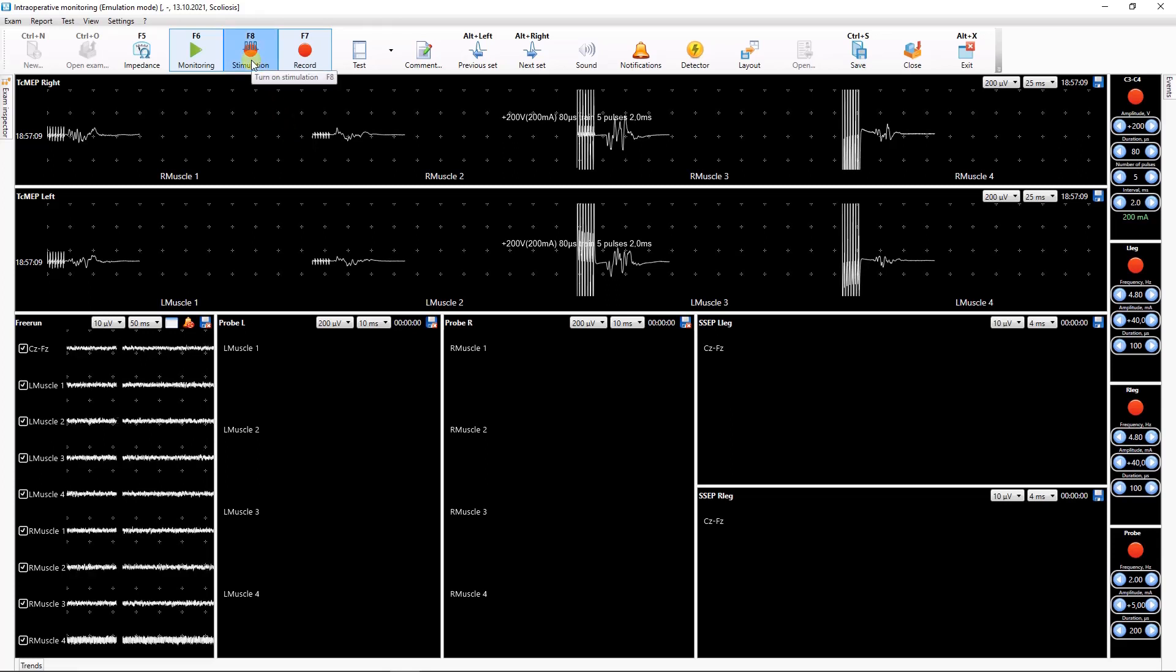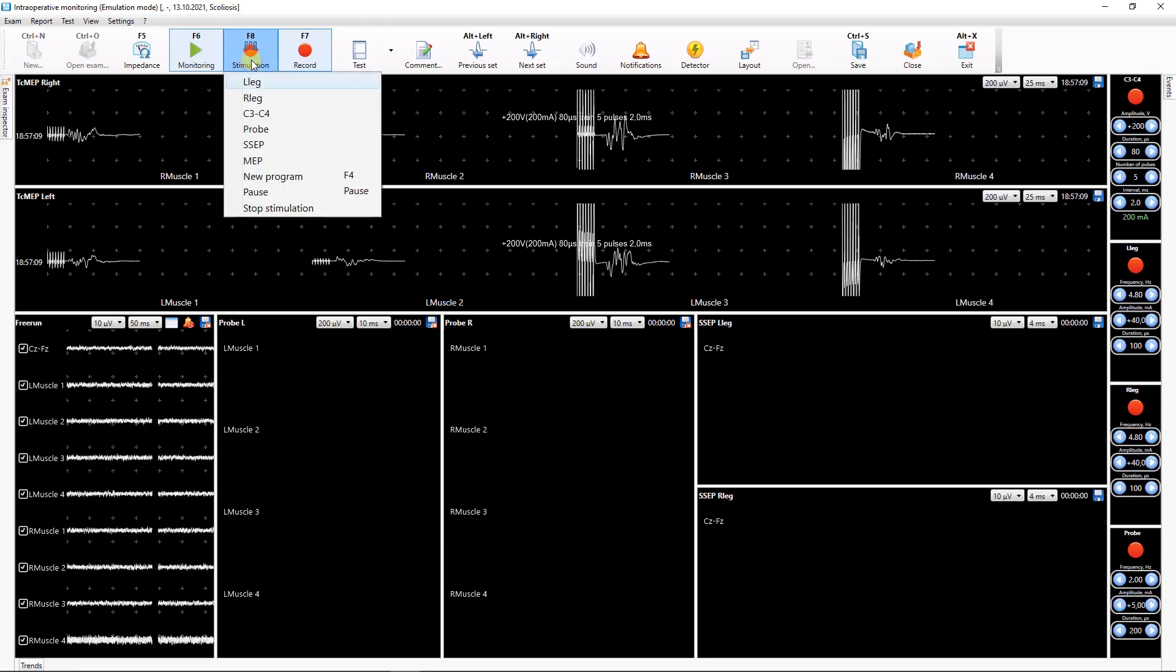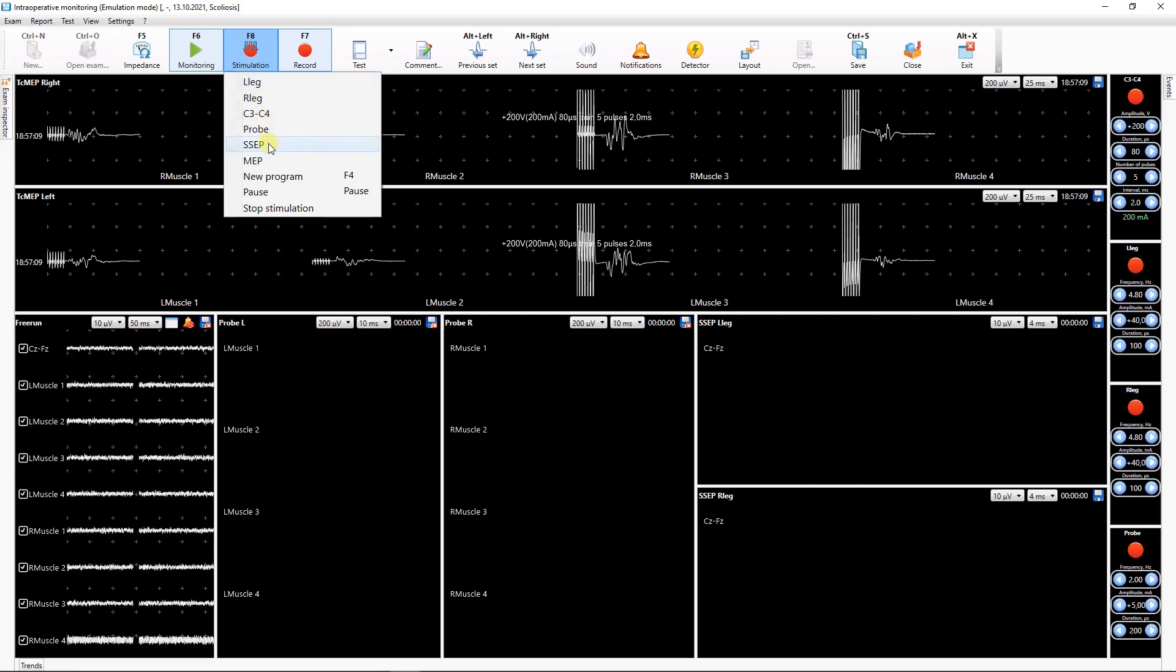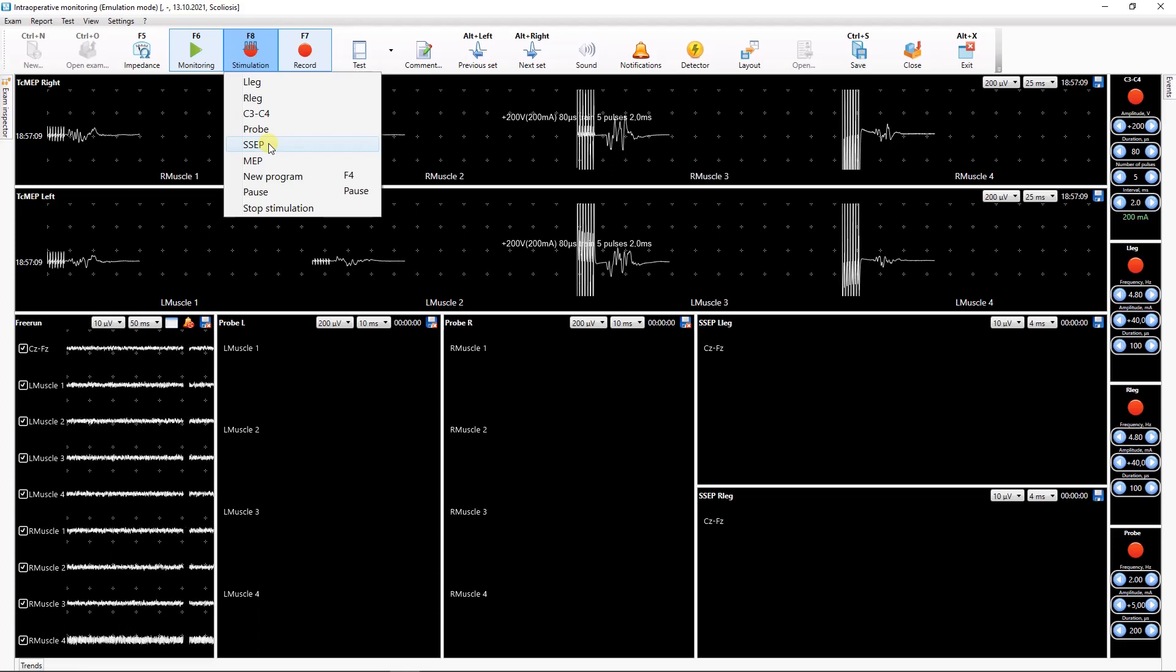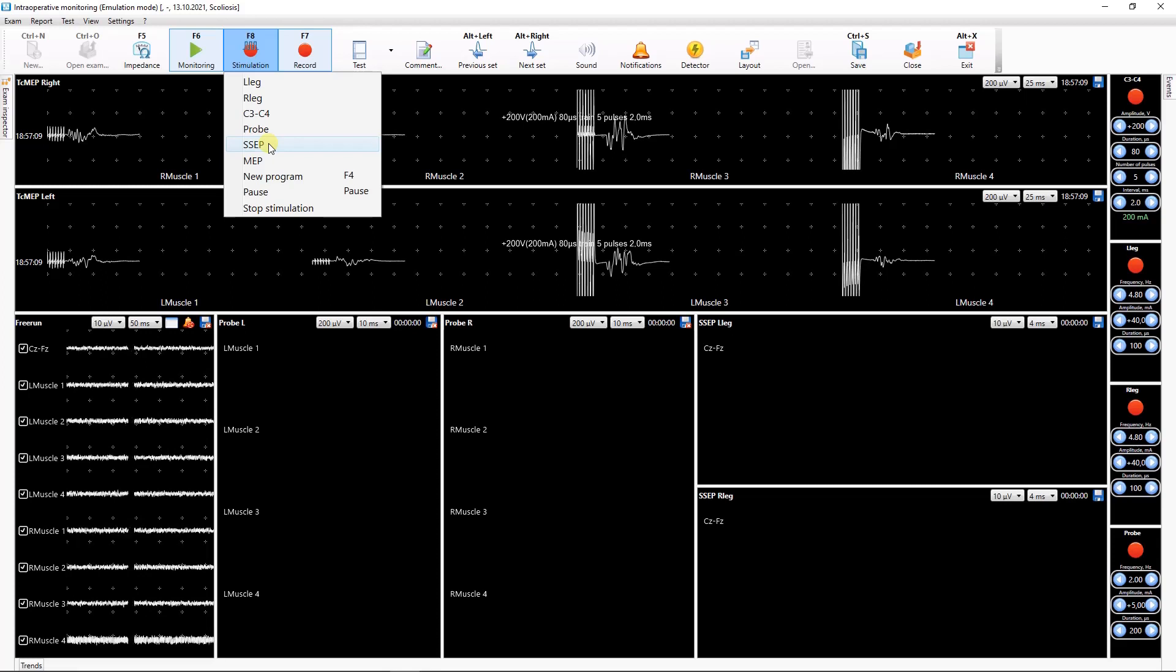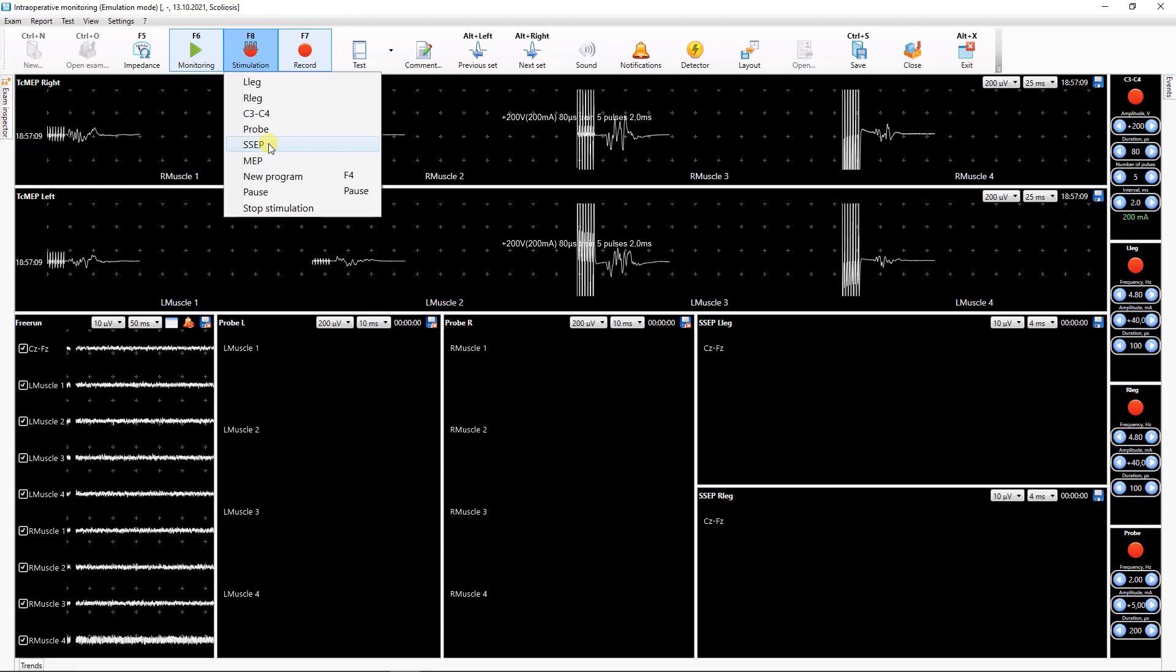You can run several programs at once. If Stimulation is enabled in one program and it is required to run Stimulation in another program, the first started Stimulation is paused and resumed after the Stimulation of the second program is completed.